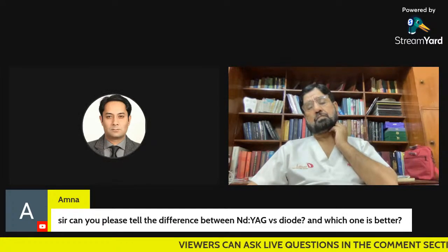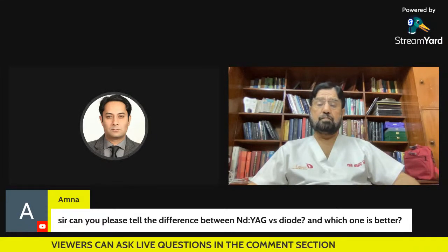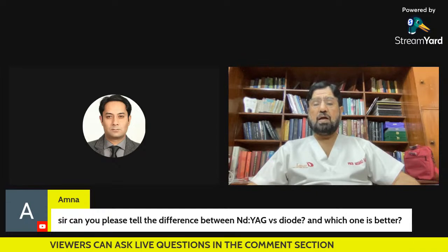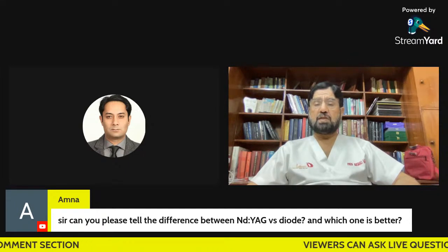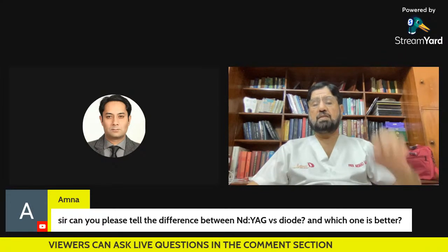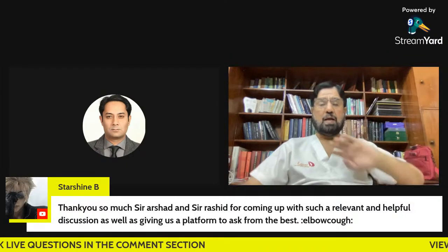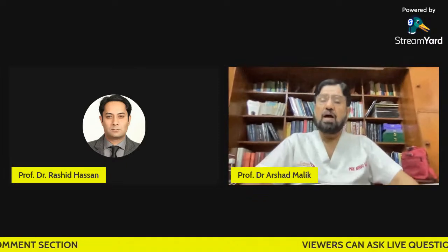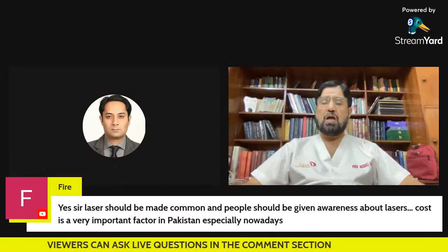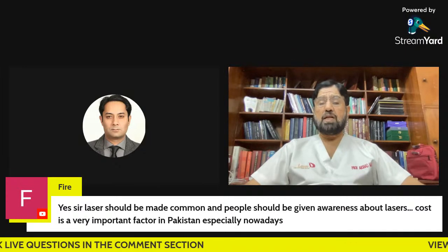Okay, sir. This is another question. Can you please tell the difference between Nd:YAG and diode? Which one is better? Both have their own application, their own indication, and own uses. Nd:YAG is a very potent hard laser and very expensive as well, and it is used for general dental surgery, especially tumor surgery, incision, evaporation, and other things. While the diode laser is a simple laser, it can be used for simple dental procedures, cutting and ablation, and gingival application and all these things. And I think the diode for routine dental surgery is better as compared to the Nd:YAG laser.